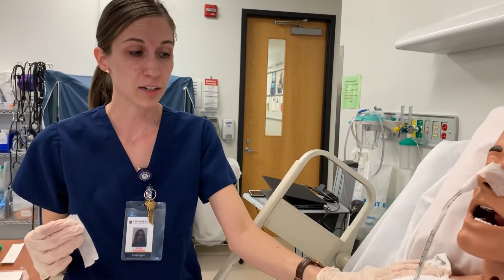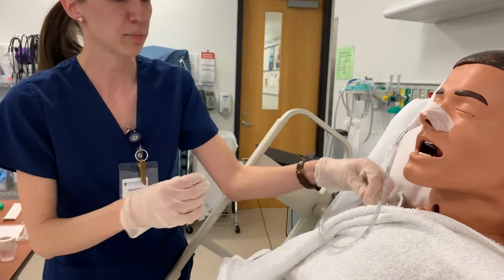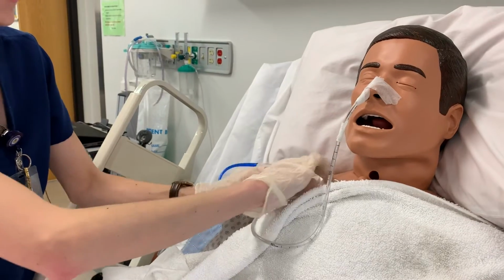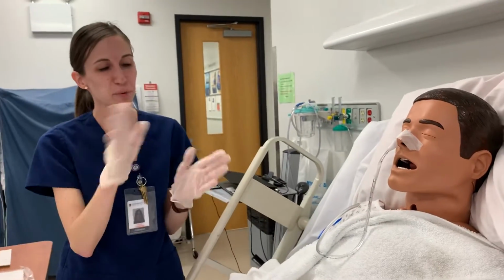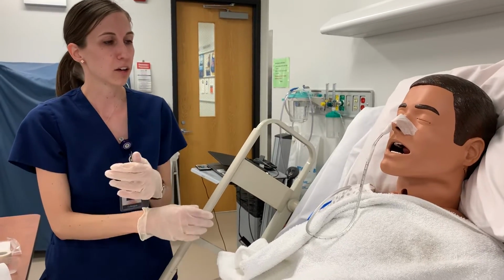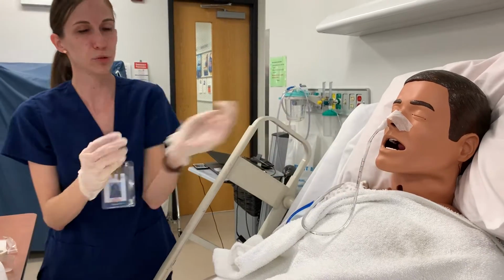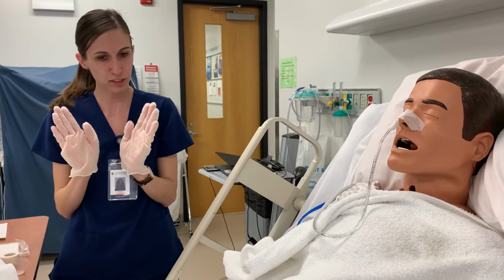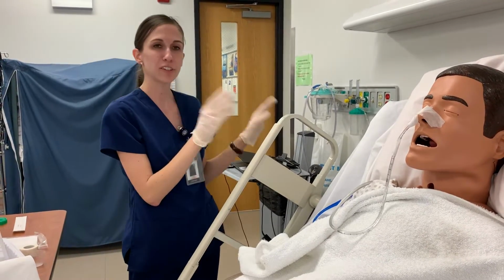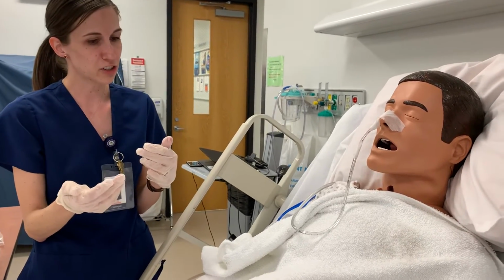I do not have a proper securing device here, so I'm just going to use a piece of tape for reference with this, but you do want to secure this to the client's gown before you do your whole removal. So again, I would make sure before I left my patient though that I left them in about 30-degree angle. And then again, I will be moving on to the removal. I think I leave my gloves on though for this because I'm moving straight into it, but otherwise, of course, you would have removed your glove, done your hand hygiene, reset your patient. But I've come back in, I will be doing the removal of your NG tube.